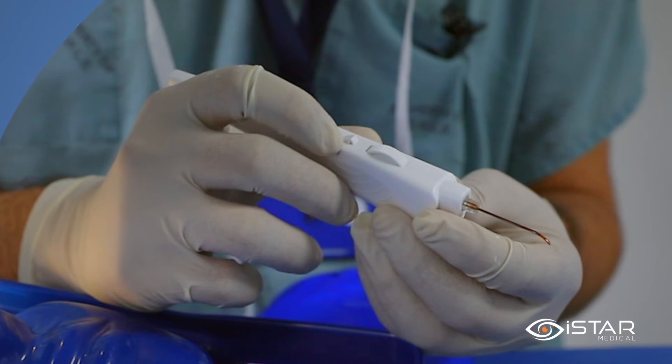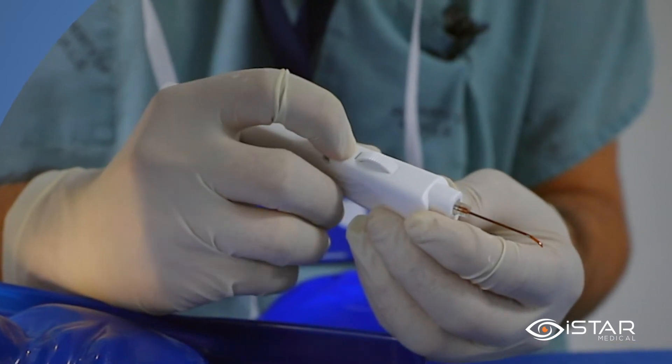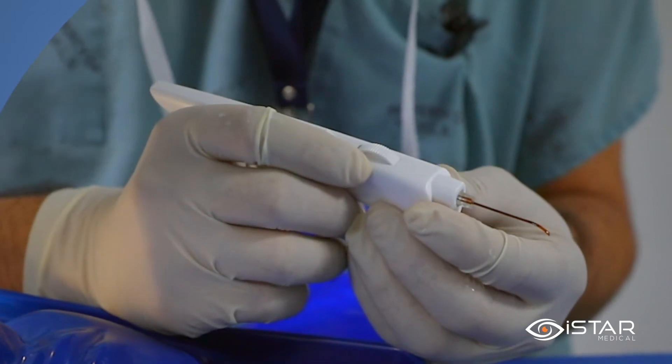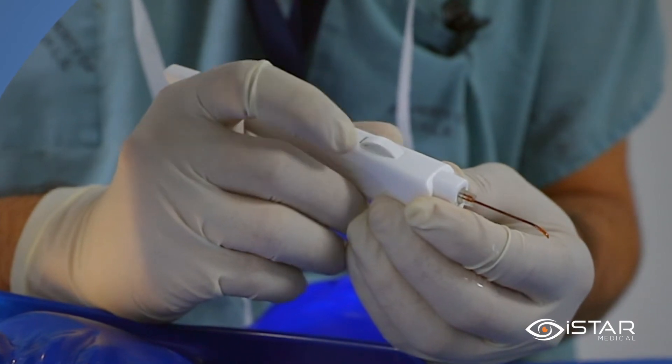To show the implantation technique, I will deliver the implant onto my finger. First, the safety is unlocked with the first digit. The actuation wheel is now ready to be used. The first digit is placed on top of the actuation wheel in a forward bias position.